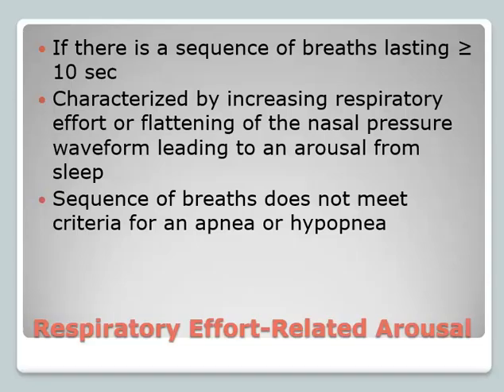But there was a huge issue of upper airway resistance going on, that these patients were having respiratory events, but they just didn't quite meet the criteria of an apnea, where they had no airflow for 10 seconds, or they didn't meet the criteria of a hypopnea, where they had that desaturation. But there was still some very obvious sleep disordered breathing going on, just not enough to meet the criteria for these overt respiratory events. That's why they developed the RERA, and that's why it's counted as part of the RDI. And that's why we go off of the RDI to establish the patient's diagnosis and severity for sleep apnea.